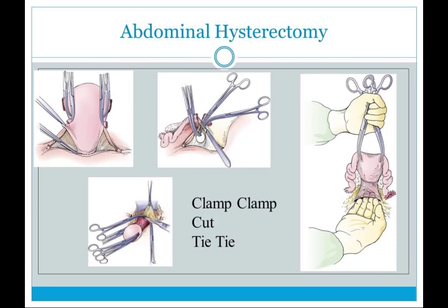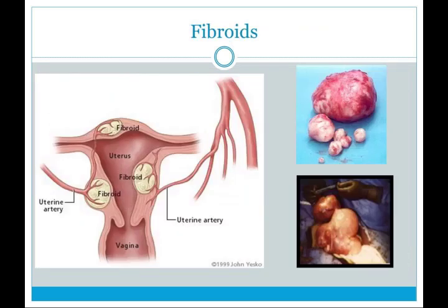An abdominal hysterectomy is a very methodical procedure. You will participate in a lot of clamp, cut, tie, so be prepared. Common suture for TAH is 0 and 2-0 Vicryl. Peanuts are often used. Sometimes the clamps are left in place on the uterus until the specimen is removed.